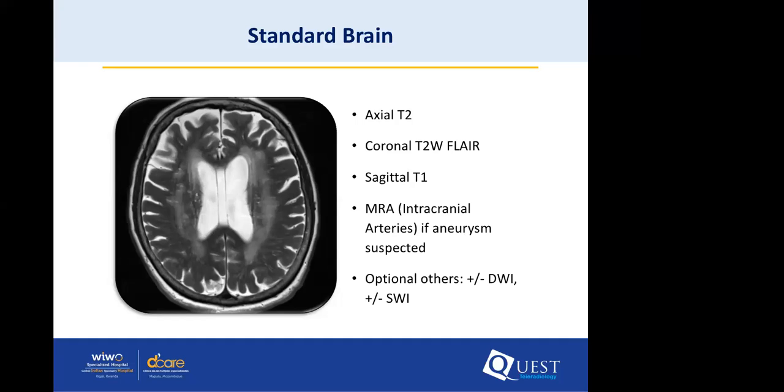In a standard imaging, your T2 is your box standard imaging, where you tend to see a lot of pathologies, edema, etc. So put that in. I've given most of the imaging over there on the right. If you want to write it down, you can write it down, or I can share this with you later, whichever way. FLAIR, because of its fluid attenuation of the CSF, tends to show up the pathology much more hyperintense, so much easier to see.